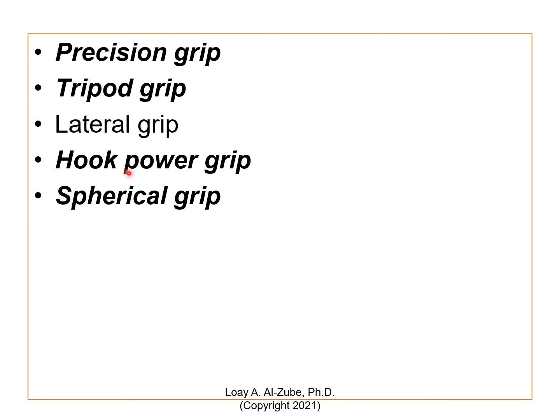A hook grip is just to hook on something and open, let's say, the door or close the door. The tripod, you have 3 fingers and you open with those. Precision grip is that you want to precisely hold something, but you don't want to crush it, so you need to have some sensors with it. And this is something we can actually design.